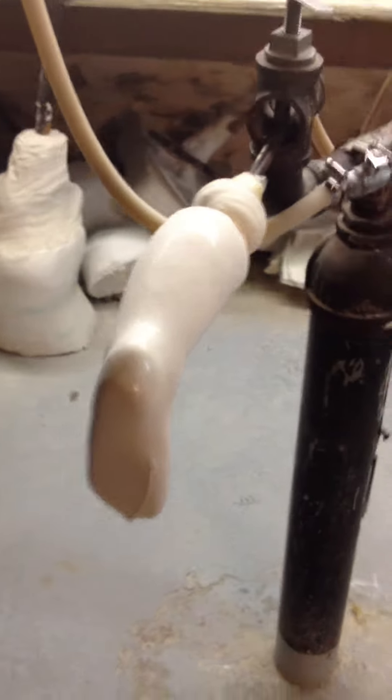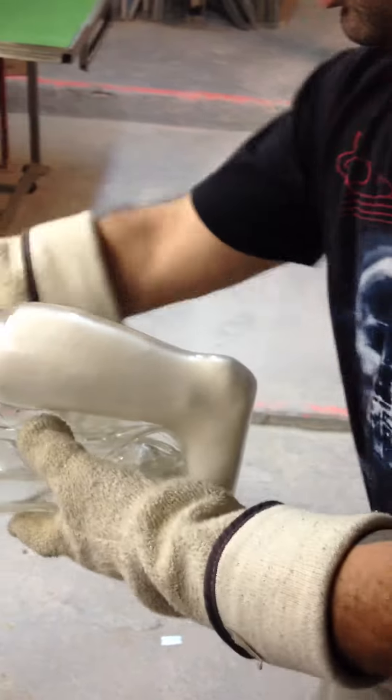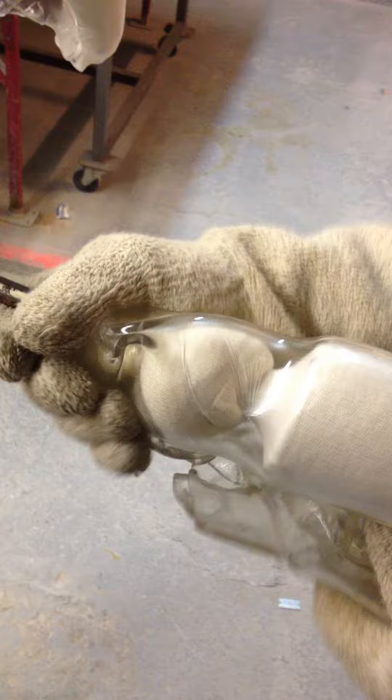This next molding is being done to show what can go wrong. Here we're laying on the plastic again, trying to get good vacuum, but there seems to be a problem. There is no vacuum.